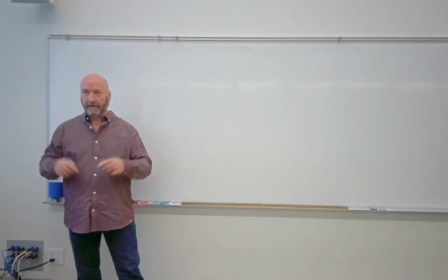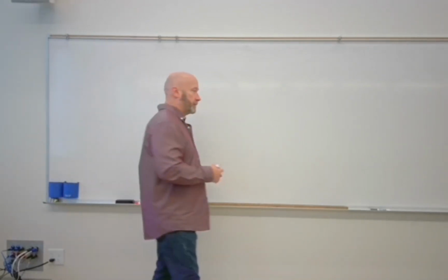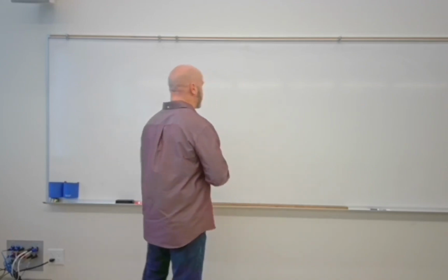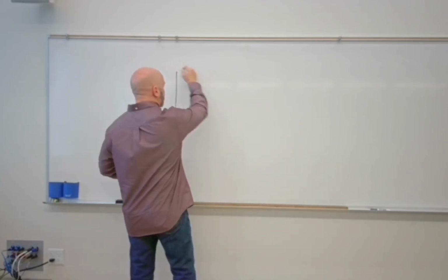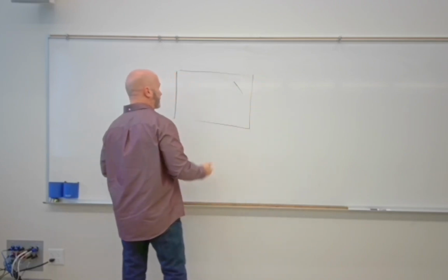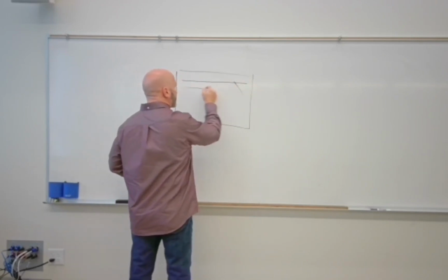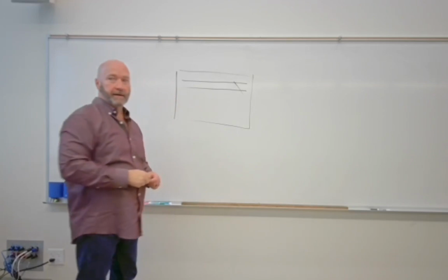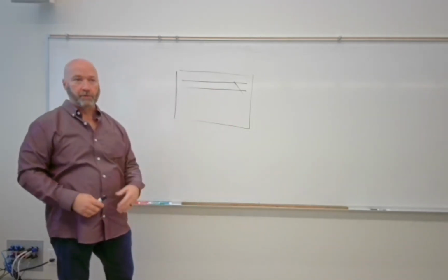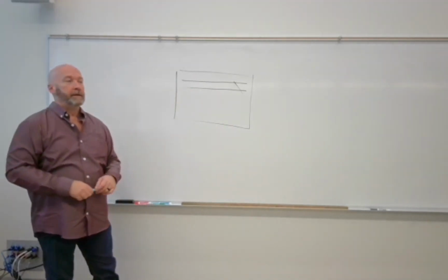So if you walk into the lab, and if you walked in, laid on the floor, and looked straight up at the ceiling, what you would see is a big rectangle with some features. But what you'll see is a set of rails that are fixed in place that go from one end of the room to the other, right? So they start over close to the window and they go almost to the door, but they're screwed into the ceiling and they don't move.